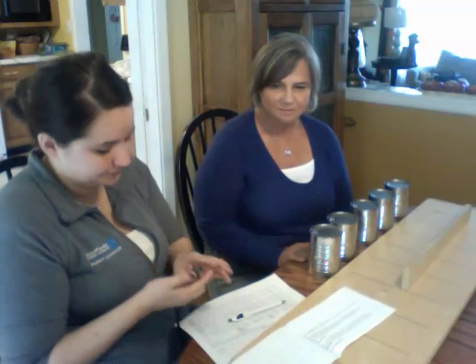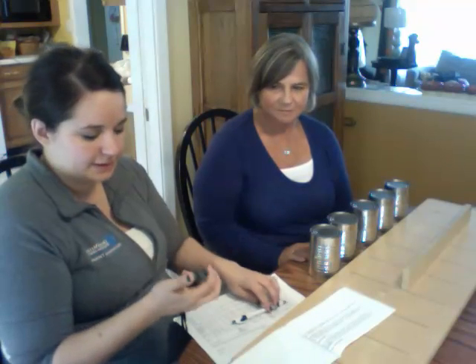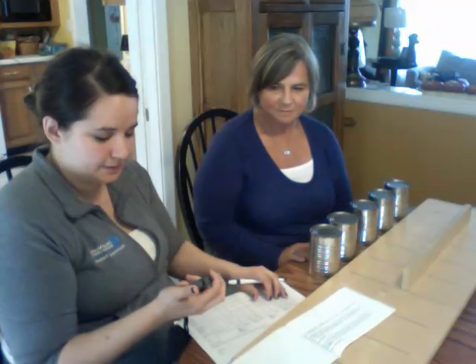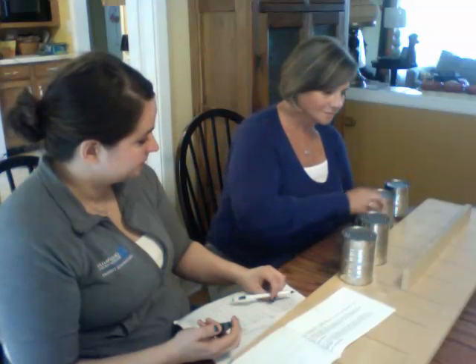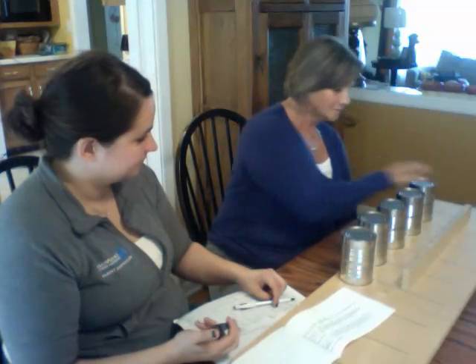All right. So we're going to do the same things with the heavier can, like I said. So place your left hand on the table, and when I say go, use your left hand to stand these cans on the board, like you did with the lighter cans. You understand? All right. Ready? Go. Very good.